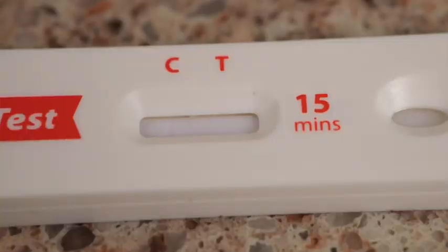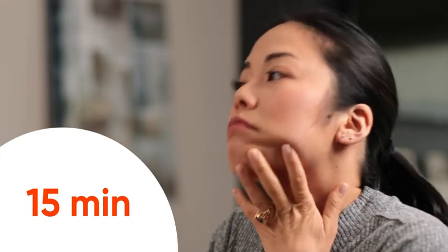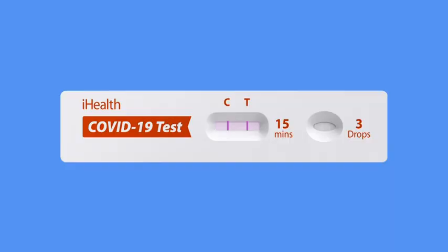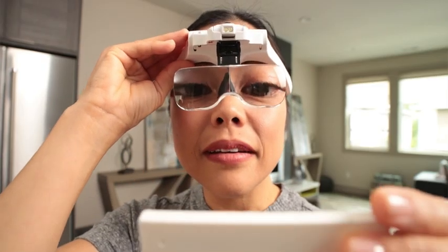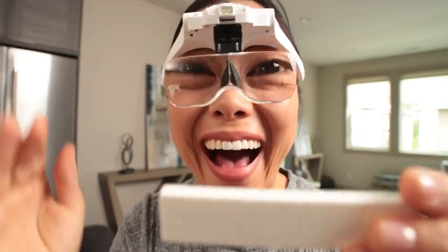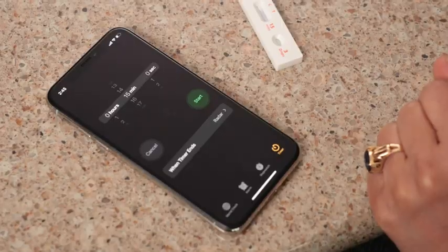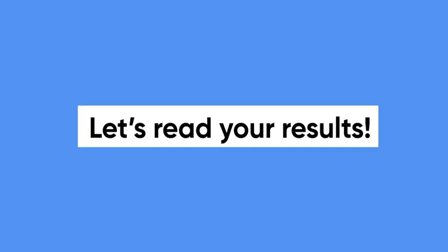Set a timer for 15 minutes. You'll see your sample being slowly absorbed into the test strip. Over the next 15 minutes, your results will appear on the test strip as lines under the C and potentially the T. After 15 minutes, you can officially read the results of your test. Be aware you only have another 15 minutes to read them before the results are officially considered invalid. It's a good idea to set another timer.